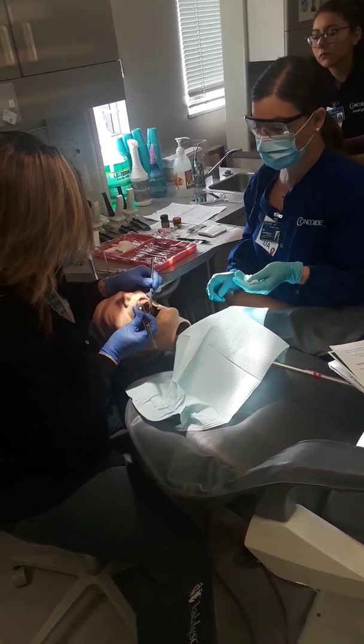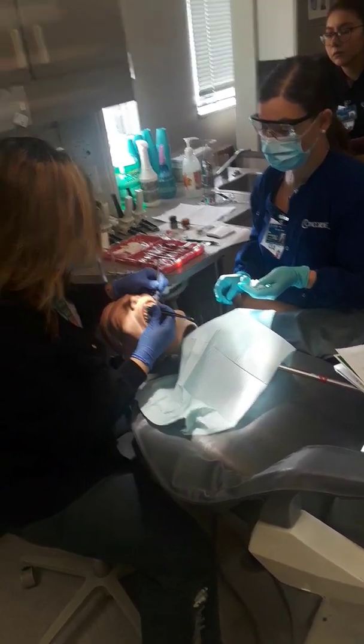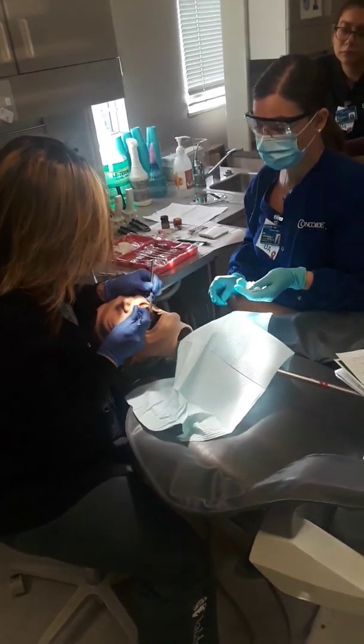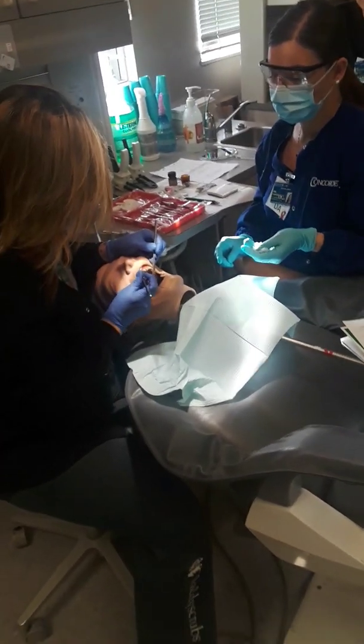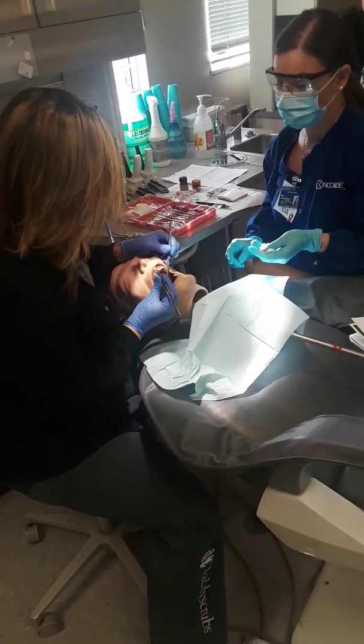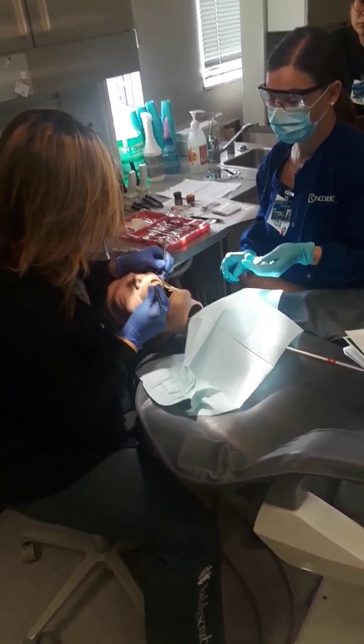How do I remove my cord? Slowly in a circular motion. That is a final question and answer: 5 minutes and slowly in a circular motion.